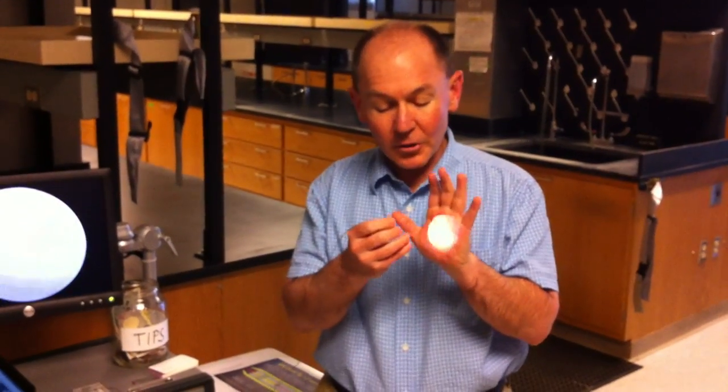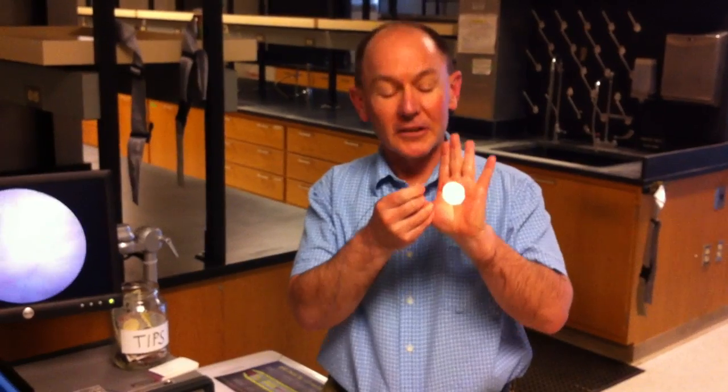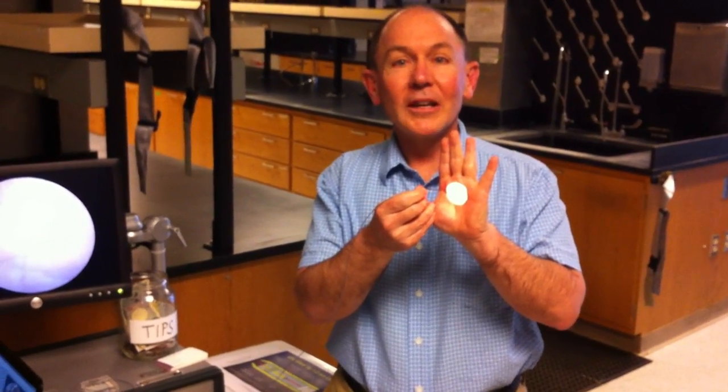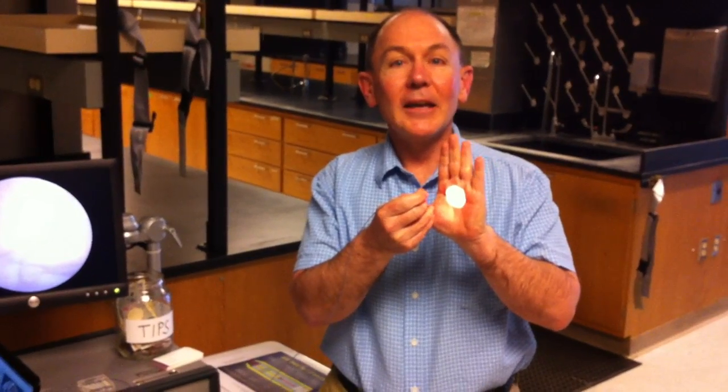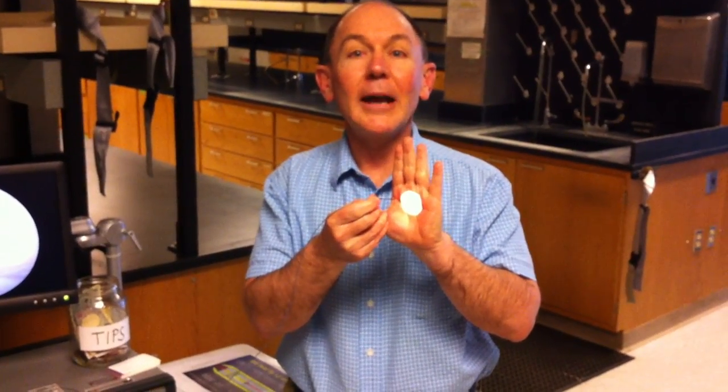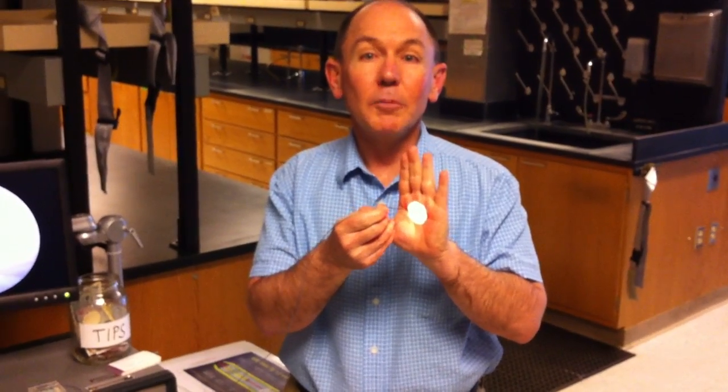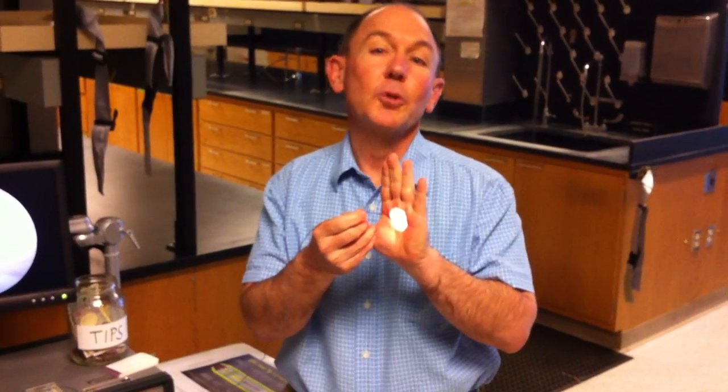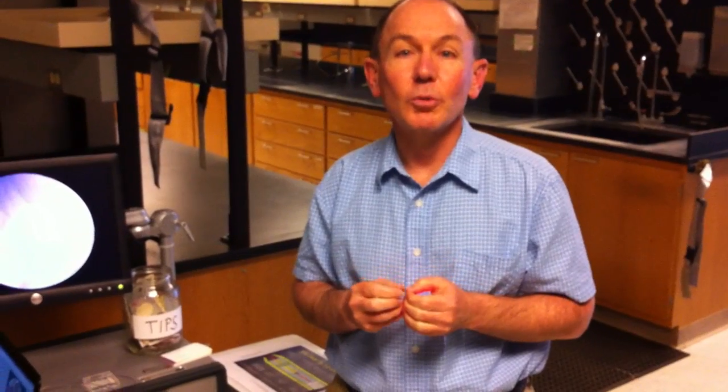And we also have another interesting thing. Since it is laser light that's coming out, you can see the pattern. If we see something, we can actually kind of circle it and then turn a high-power laser on when the laser flashes and burn it out, right, when it's small and before the cancer has a chance to spread.